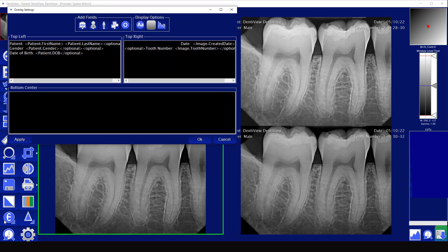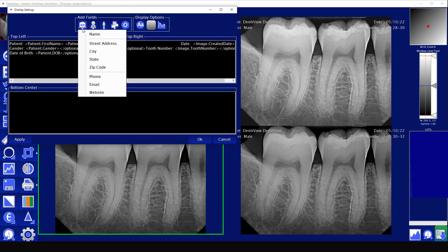The cogwheel is going to bring up different settings for the overlay settings of what shows up in certain images when they are printed out.